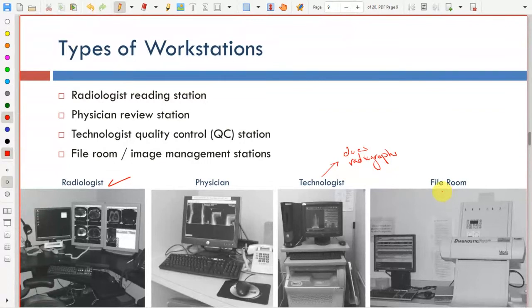Okay, or if you have some of the imaging systems that don't have a digital interface, so that you can get a film, or you can get an image print out, and this is all you can get. You cannot convert it to digital.